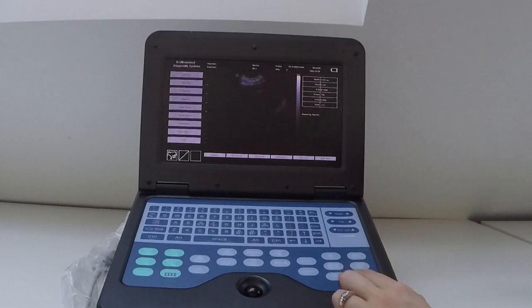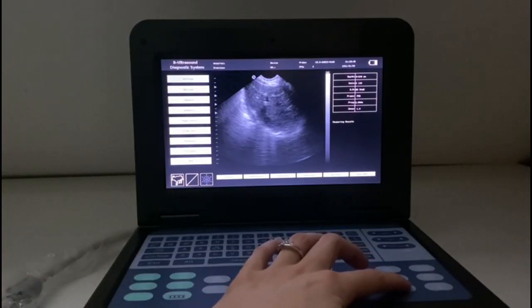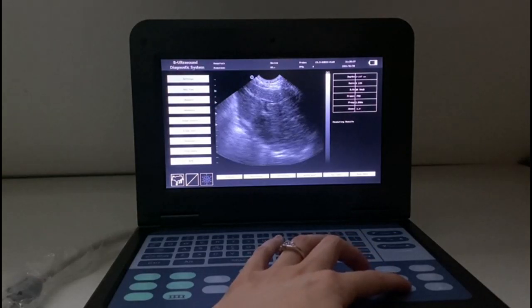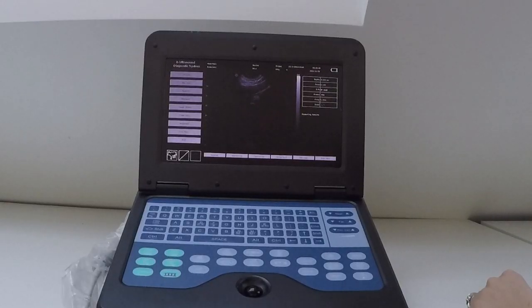Depth is the other important control, located here. In general you want to start with that quite far out, and then when you've located a pregnancy and want to look at it in detail, reduce that depth so it fills up most of your screen.